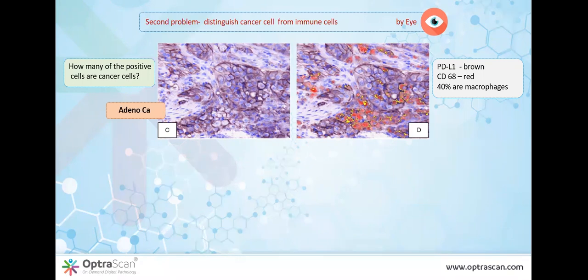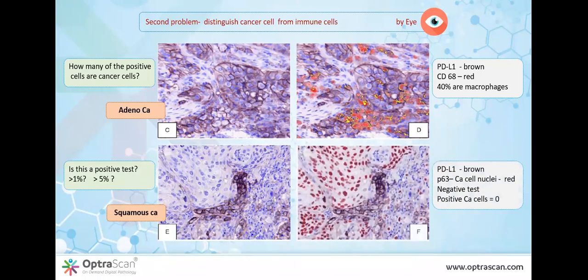But if we're going to score accurately, we have to go beyond the population to identifying individual cells. So this is one problem with the scoring process. I'll show you one additional slide that emphasizes the problem again. Here we've done it slightly differently.